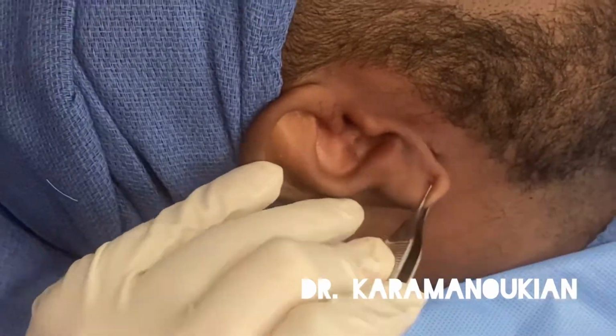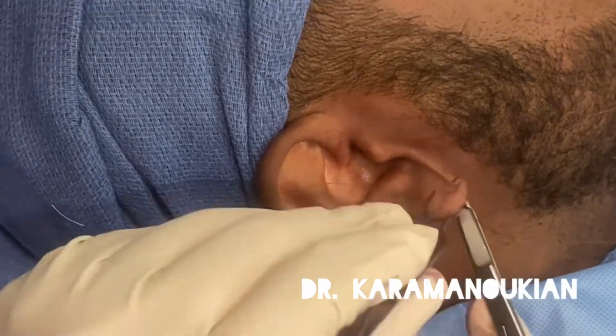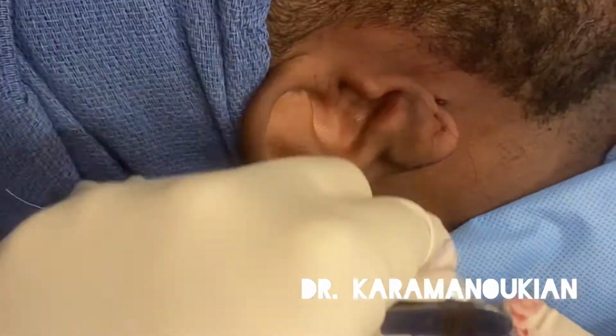I'm putting a tacking suture to minimize bleeding afterwards. You can see that there's no drains and minimal bleeding. The surgery is a complete success.